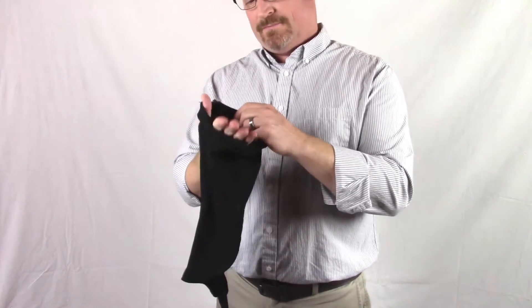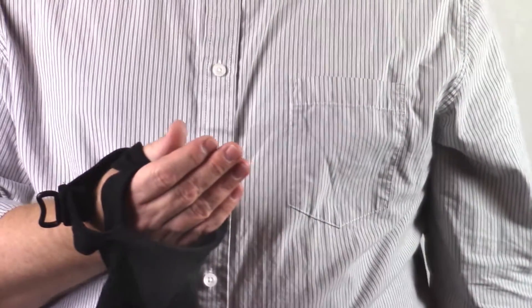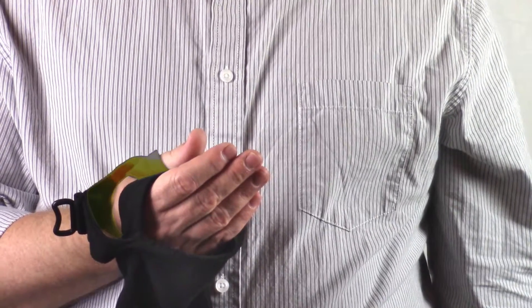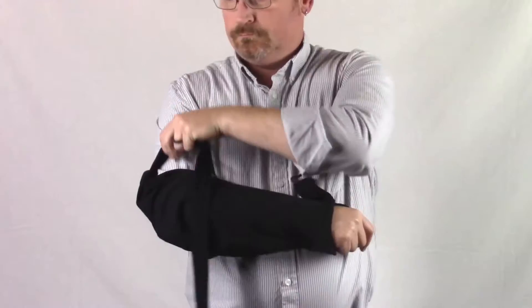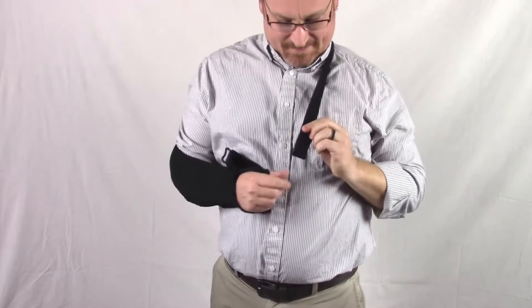Your hand is held securely in the sling by two loops. Place four fingers through one soft cotton spandex loop in the front and your thumb through the opposite loop nearby. Then stretch the sling over your elbow and bring the strap around your opposite shoulder.